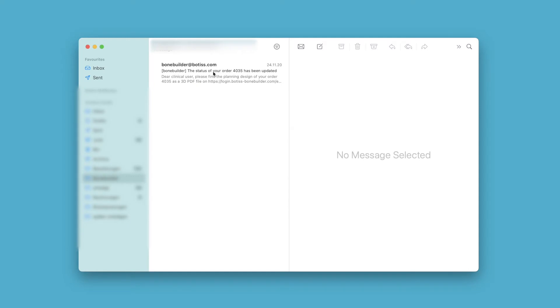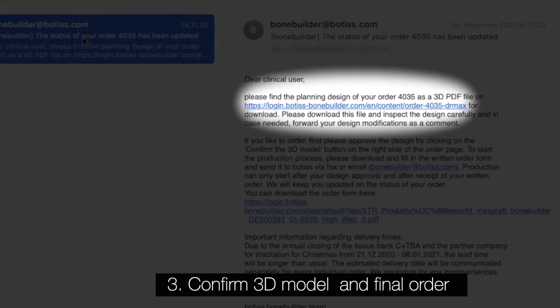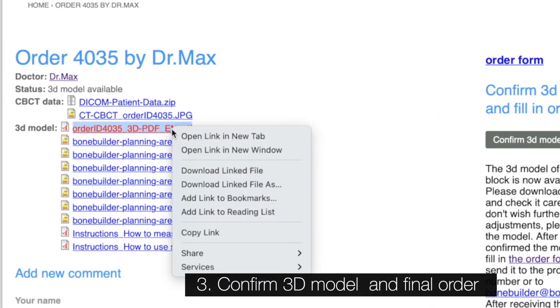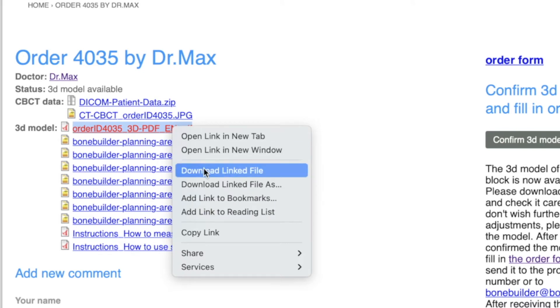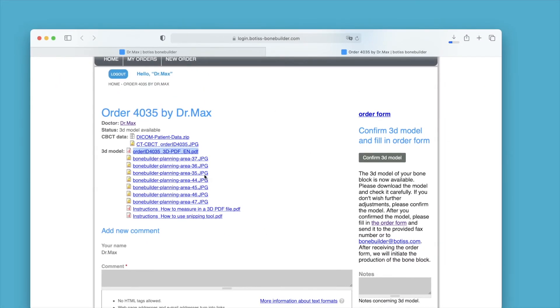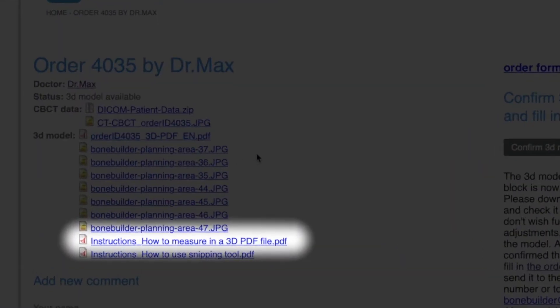Under my orders or if you are still logged in via the direct link in the email, you can now download the planned model as a 3D PDF. You will also receive an instructional PDF to help you with the 3D view.